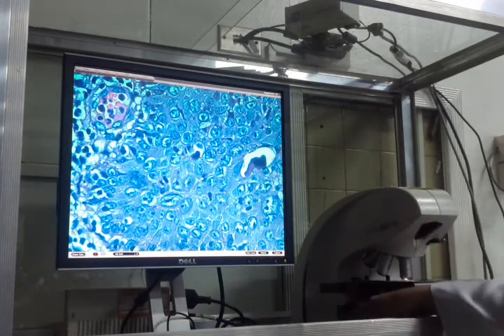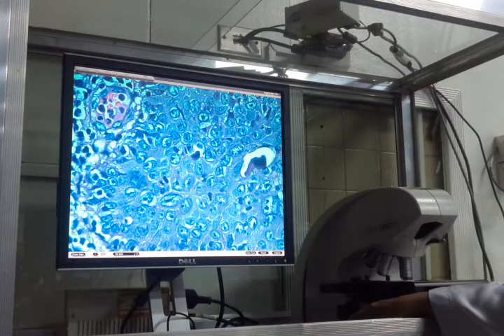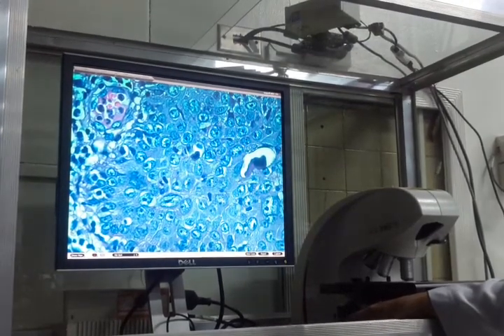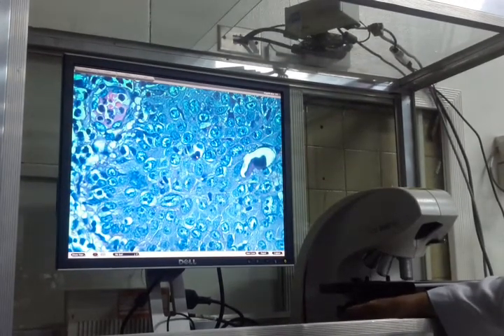is something like this cell over here. Okay? If this is focused to you, something like this, that's an apoptotic body. It represents apoptosis or programmed cell death. Okay? So this is a squamous papilloma because it is a neoplasm, as it is, you have an apoptotic body.